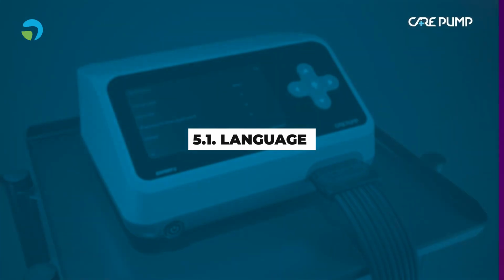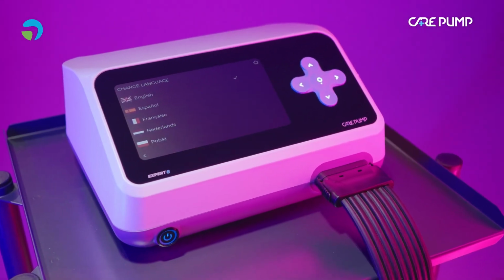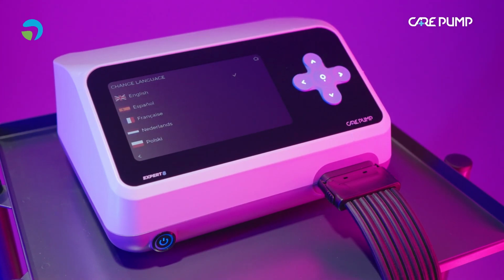Language. To change the device language, select Language button. In the next step, an alphabetical list of available languages will appear. The active language will be marked with a check mark.